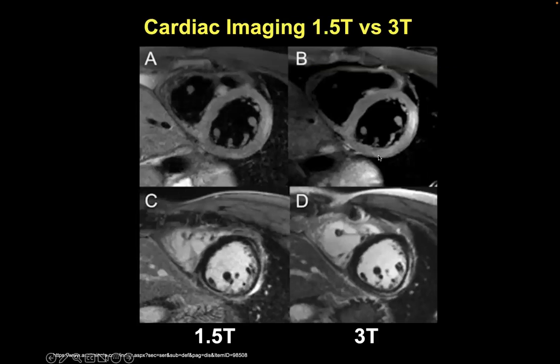Example, I guess I put this in here as just a comparison. If you buy a 1.5T MR scanner, let's say it's $1.5 million, then this one's going to be about $2 million or something. It's going to be an extra chunk to get this higher magnetic field. And the question is, do you need it for cardiac?